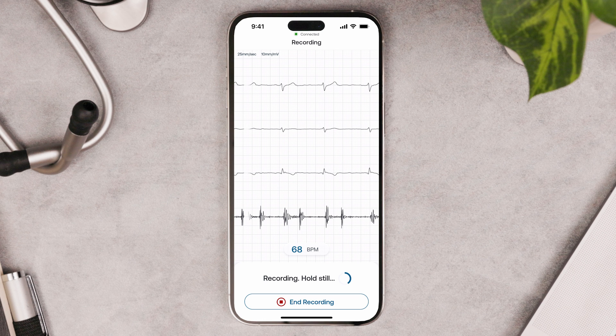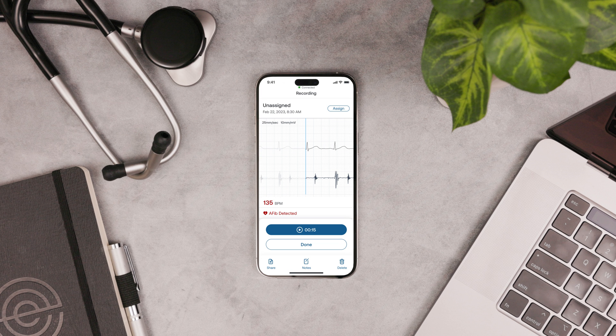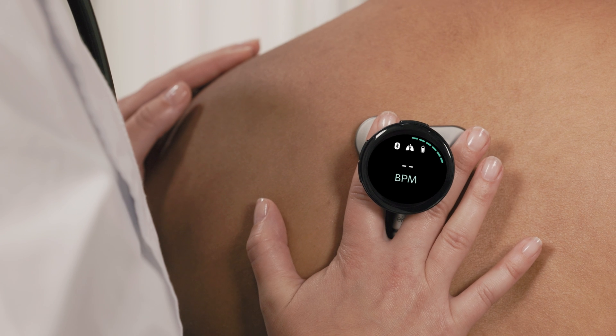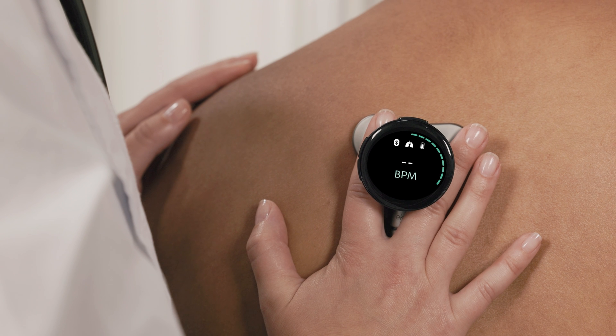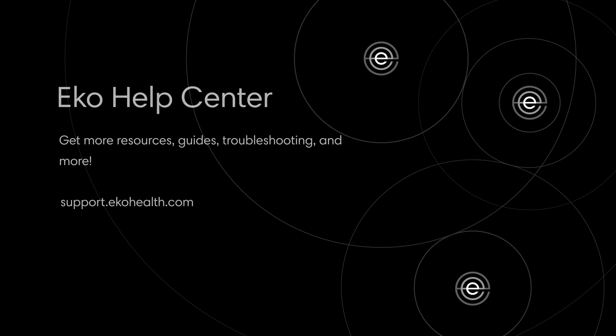We recommend using the Eko app to read and interpret the full 3-lead ECG. If you have AI analysis turned on, you'll see results right on the screen. You can open the Eko app later to review the recording and analysis results. Now that you've learned the basics for the Core 500, you're ready to go. You can learn more in our Help Center at support.ekohealth.com.